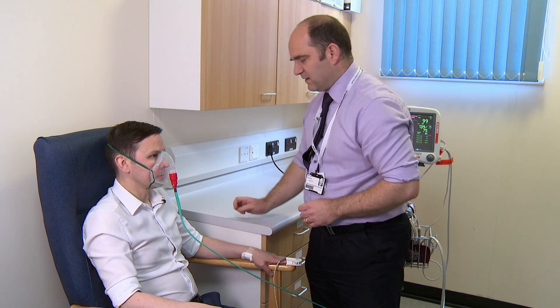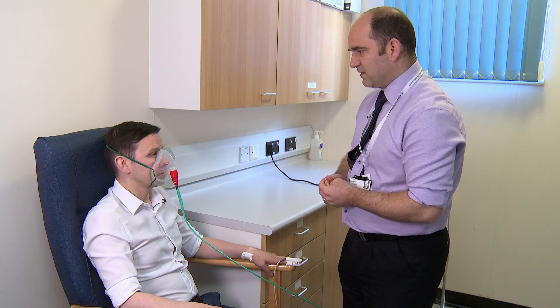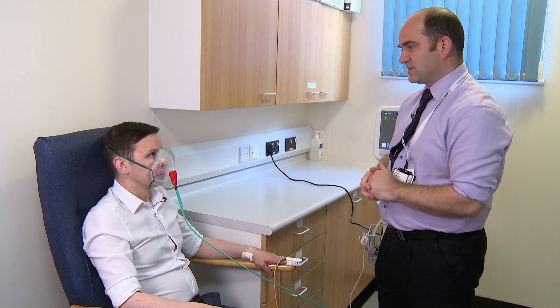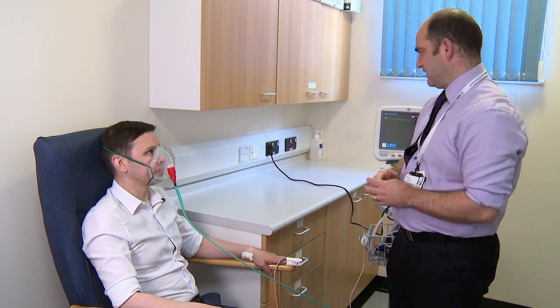Not too tight? Is that okay? Yes. Make sure there are no leaks. Fantastic. So I'm going to start the test now. I'm going to let the 15% oxygen come through the mask. Just nice and relaxed, and I'll stay with you. We'll just keep an eye on the oxygen levels as you're breathing there. Okay? Yeah. Fantastic.